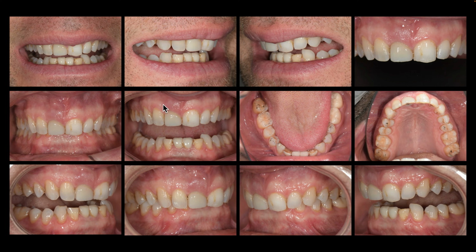The tissue levels weren't quite right. The implant's not quite as deep as I'd like. I'd rather this implant be deeper, but it was something that we could work with. And then he has two one-piece Nobel 1 implants on the lower central incisors. This is a discontinued implant, and it became a pain to replace the crowns on them because all the parts are discontinued.